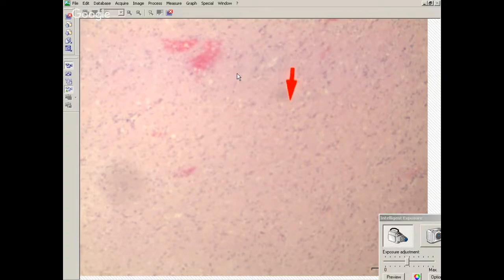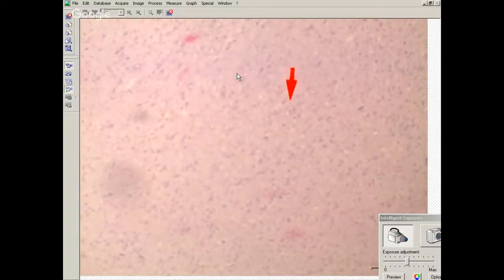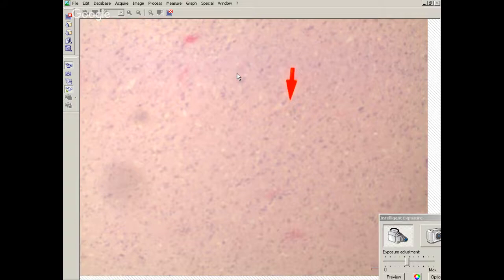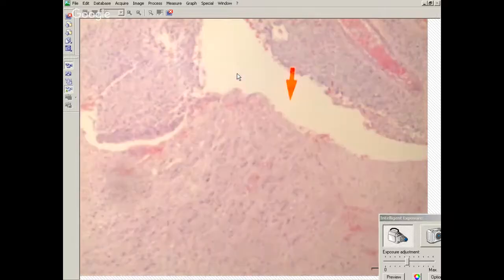So your control is always looking at the blood vessels of the tissue to make sure that the blood vessels stain with ATRX. That's your internal control. If the blood vessels don't stain, then your internal control is not adequate, and you can't say that the tumor cells have lost staining. Something like INI1 staining, right? INI1 is for an atypical teratoid rhabdoid tumor, which is a whole different entity. To look for loss of the mark. Yeah, so it's the same. Yeah, so it's loss. Okay. But yeah, so in that same regard.